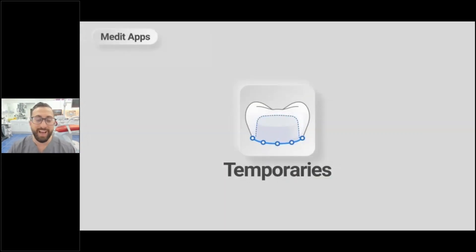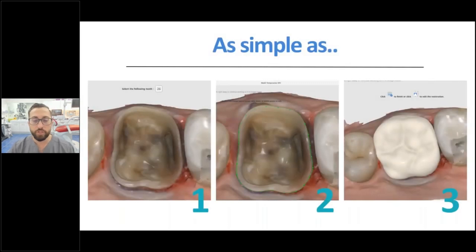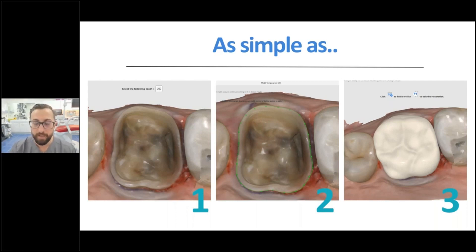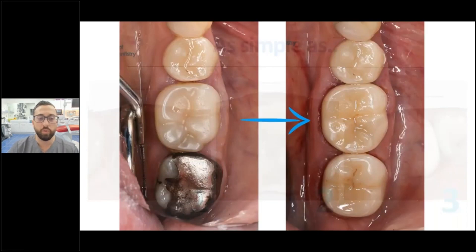Temporaries was a popular app, and I felt like it was the company testing the waters before developing their Clinic CAD app. Medit Temporary was released and initially required a pre-op scan, then they developed their own library, then added AI. Now you can make a Medit temporary crown in just a couple of clicks — you import your scan, delineate your margin line just like Exocad or Cerec, and the AI with a tooth library creates the temporary crown for you.